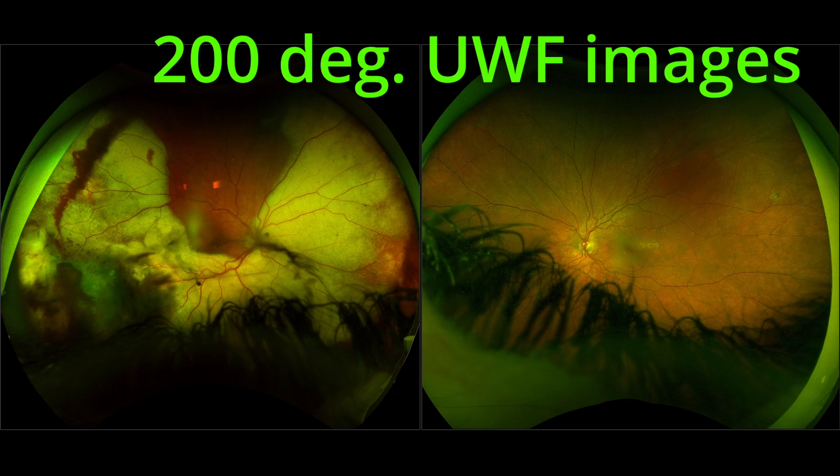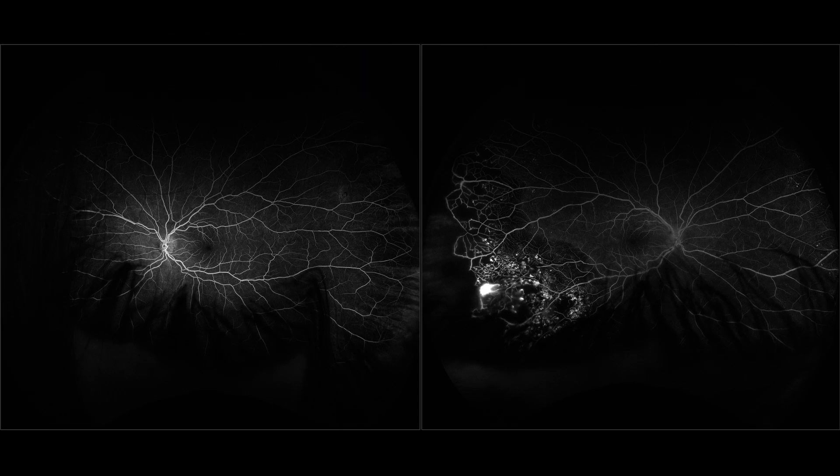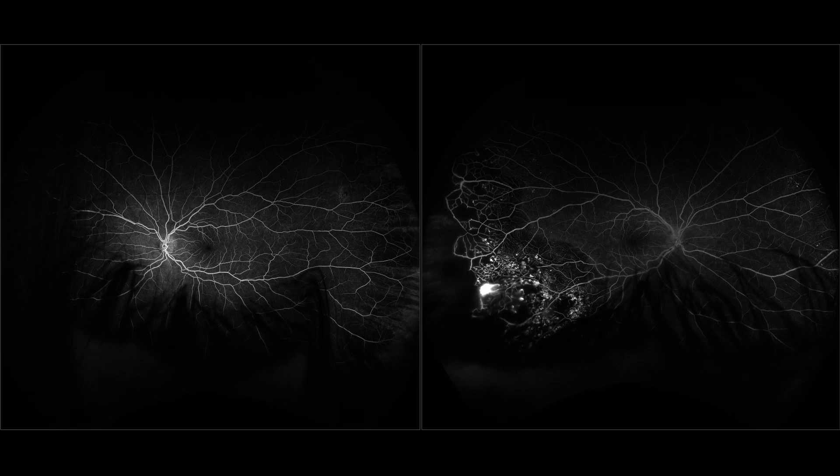Optos is great for the periphery because you get 200 degrees in a single image. For very uncooperative patients who can't fixate, it's impossible to do mosaics, so a 200-degree single-shot system is amazing. However, it takes very long to get a nice shot because just getting the patient's head inside the machine is difficult. During FA, if the patient moves their head when the dye is being injected, you lose 30-40 seconds of the most important part of the angiography, and Optos also doesn't record movies.